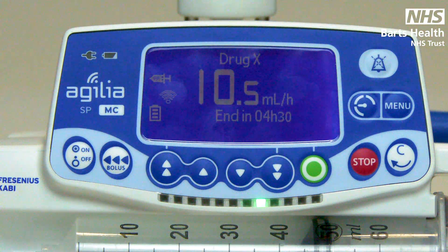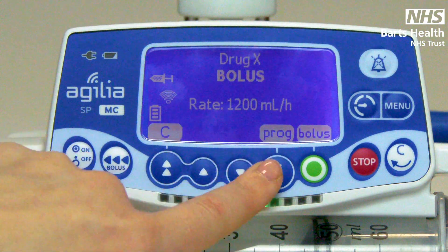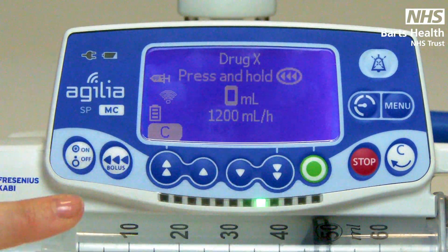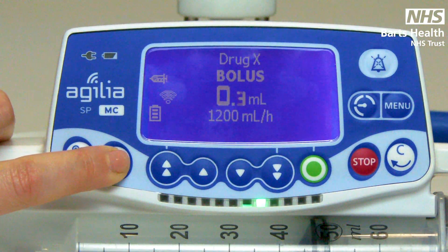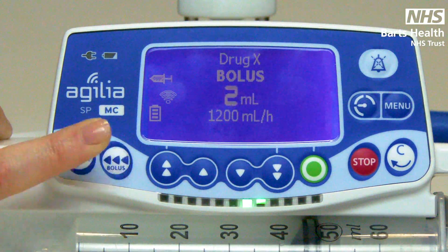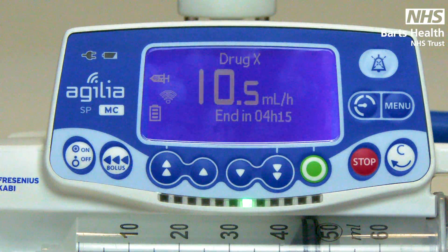There are two methods to bolus your drug. You do not have to stop the infusion to begin either. Press your bolus key once and both options are shown. First is manual bolus — press and hold the bolus key as instructed on the screen. As long as you are holding the key, you are delivering a bolus. To stop the bolus, just release, and the pump will then go back to your original infusion rate.